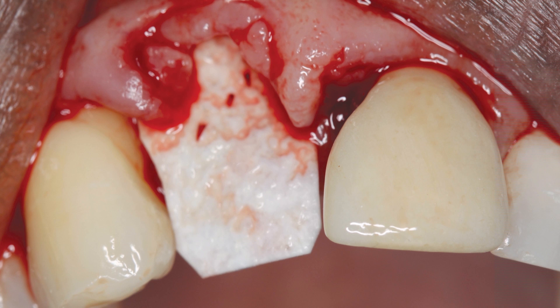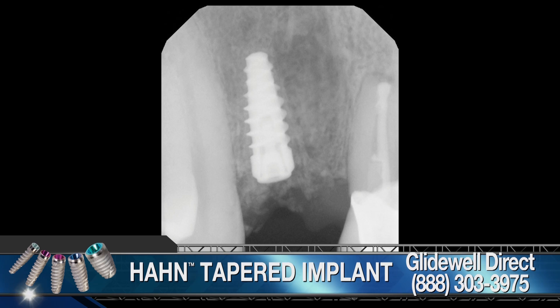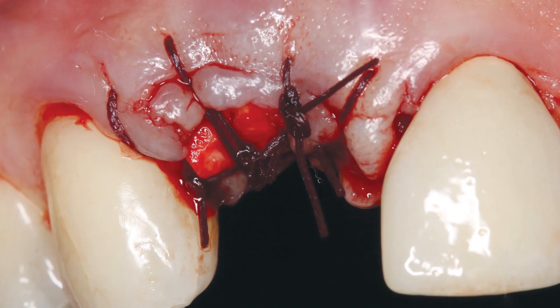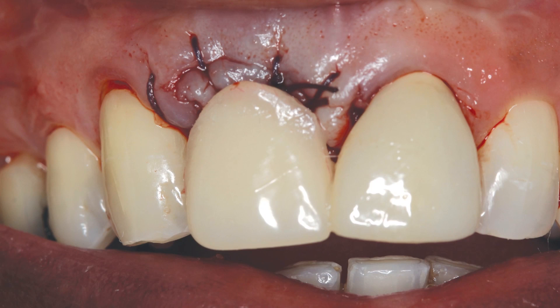The gingiva can then be easily sutured and the membrane will not dislodge. The Hahn tapered implant was threaded into the osteotomy and then tightened to full seating with a torque wrench. The prominent thread design of the implant allowed for precise, straightforward placement. Radiography confirmed proper positioning and full seating of the implant. A flat cover screw was hand tightened into the implant to minimize the pressure exerted on the implant during healing and osteointegration. The resorbable membrane was then tucked over the crest of the ridge and engaged at least 2 millimeters of the palatal bone. The flap was closed with Villet Plus sutures from Riverpoint Medical, which demonstrate the high tensile strength critical throughout the healing period. The maxillary flipper appliance was created to cover the palate, protecting the treatment site from excessive pressure.